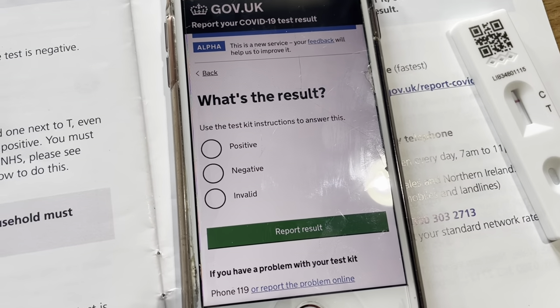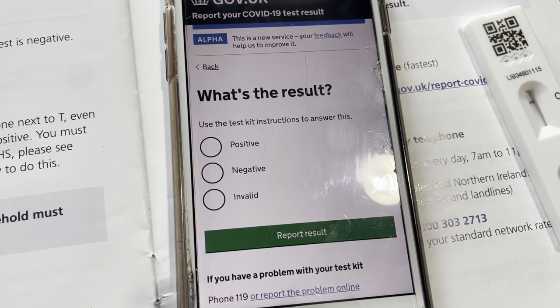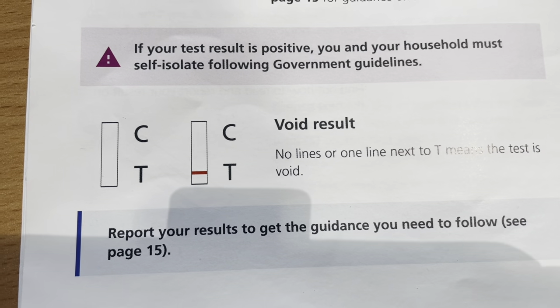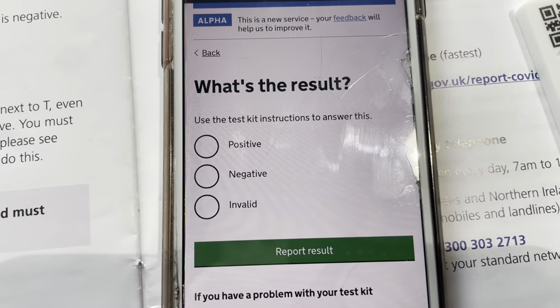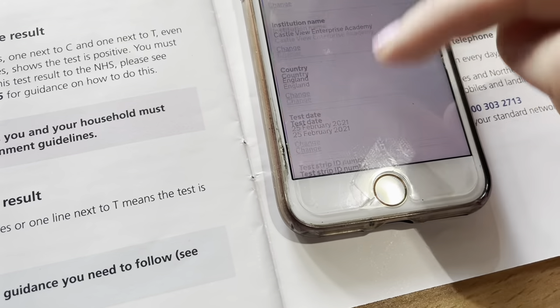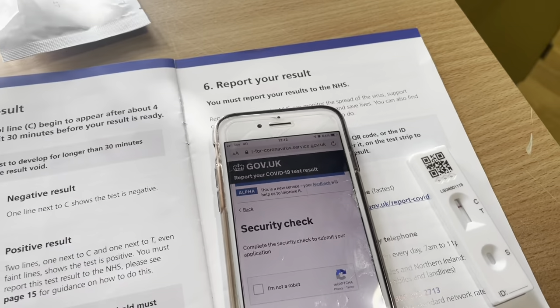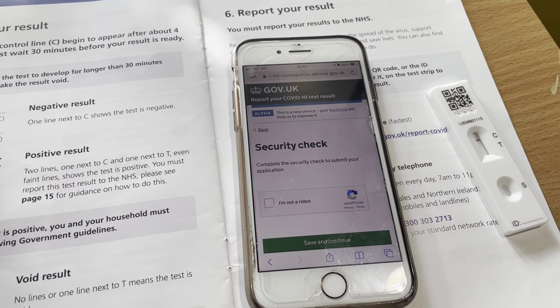Once you've entered your personal details, you'll come to 'What is the result?' and enter whether it's positive, negative, or invalid. If you get an invalid result, it will look like one line on the T or no lines at all — that is a void result. Enter positive, negative, or invalid as appropriate — mine was negative — then report the result, check your answers, and submit. It will then ask for a security check.